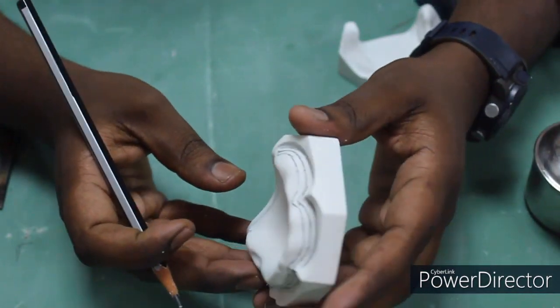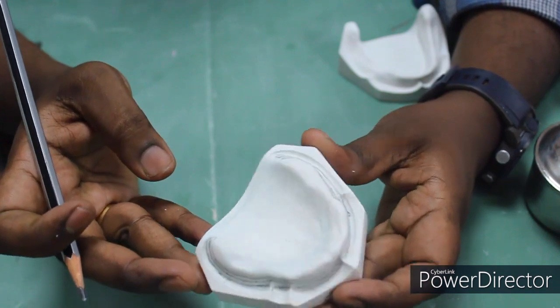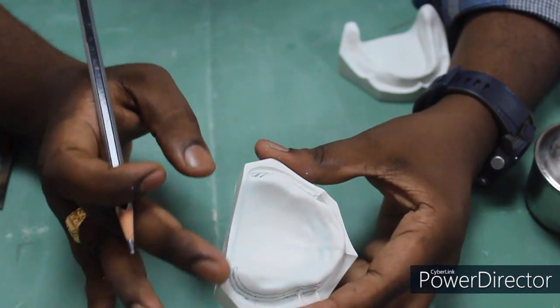So far I have drawn in the sulcus region. Now I am going to complete the posterior palatal region.